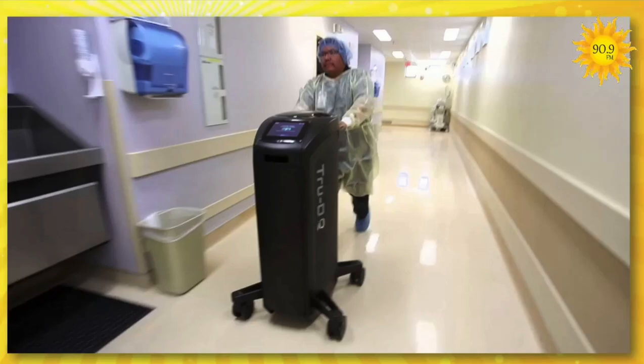Well, right. In healthcare, we're really more concerned about the things that you cannot see. Right. Wiping down everything in the room. Because C. difficile, for instance, is something we do have in the community, and it could live on a surface for 6 months if it's not cleaned properly. And we don't use your typical disinfectants, your Mr. Clean, your Lysol, the stuff that you buy from the store. We use a Sporecide, a hospital grade disinfectant. It's very top of the line, and we use it in all of our rooms daily.